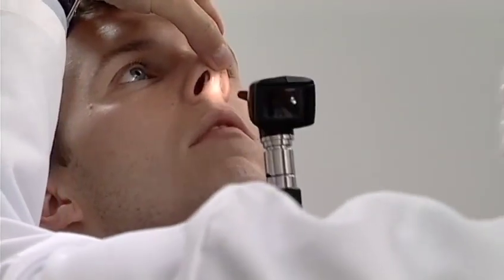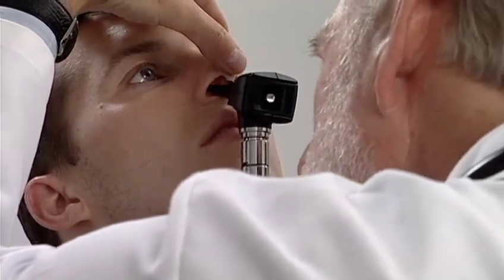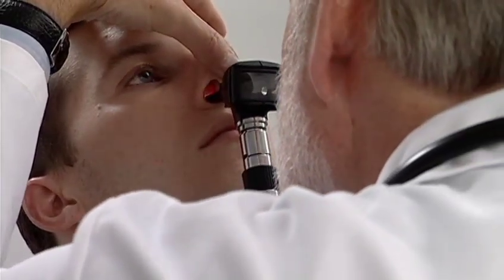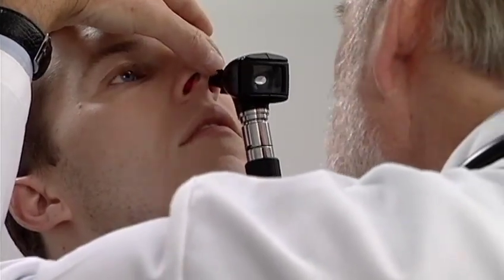The turbinates are on the lateral aspect of the nose, three on each side, and we're going to look towards those. So, again, keep the nasal speculum aimed away from the nasal septum, as the nasal septum can be quite uncomfortable.